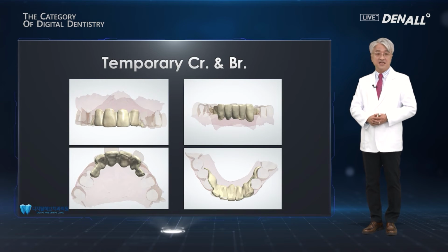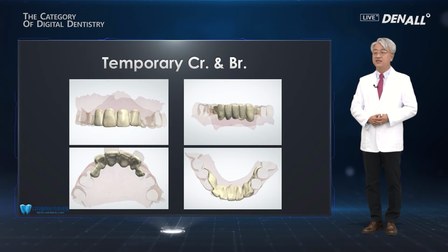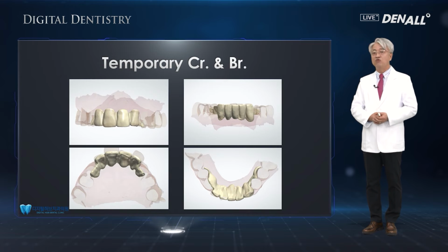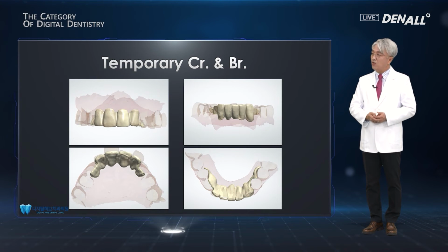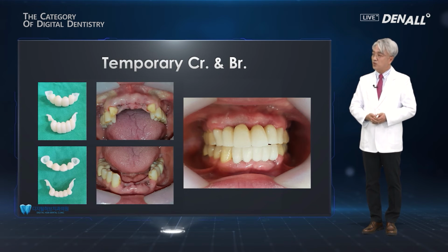The most widely used case is temporary crown and bridge or temporary denture, in prosthesis or implant surgery. We use them a lot, so the share of temporaries clinically is very high. With CAD/CAM, a Maryland bridge can be created like this as a temporary, and a ready-made Maryland bridge and general temporary bridge is delivered to the patient.